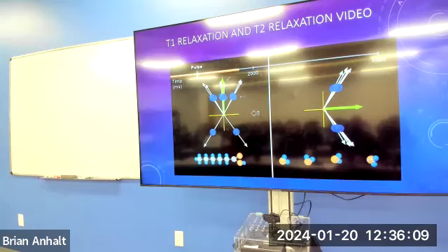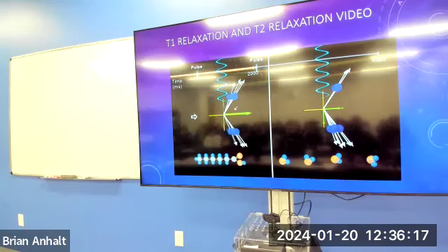If we then quickly put in another resonant 90-degree radio frequency pulse, the fully recovered fat protons will produce a large transverse magnetization and a strong measured signal that we can record if we listen to the return signal or echo shortly after the second radio frequency pulse.